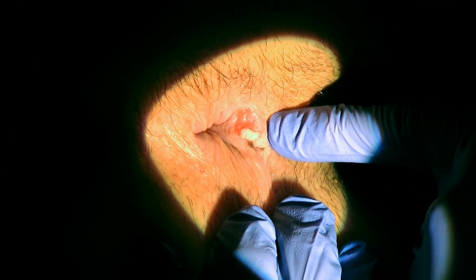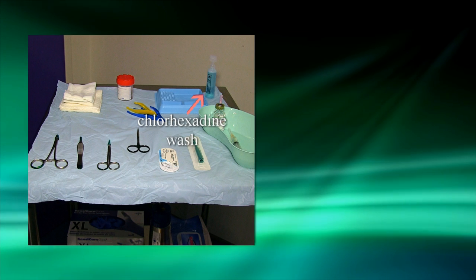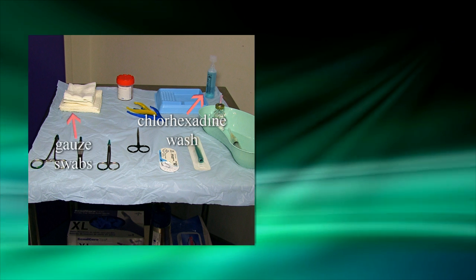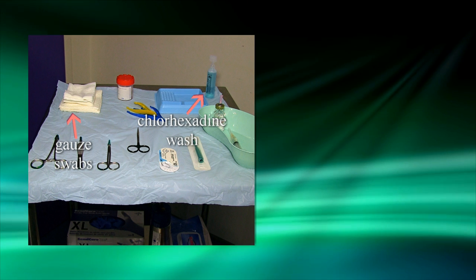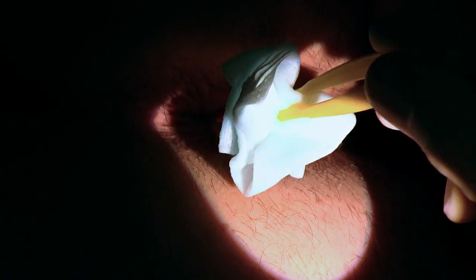I'm going to take a biopsy from that area which is still quite angry looking. I'm using some chlorhexidine wash, which I'll be applying to the area using a gauze swab. This is a little bit cold and wet, so don't be surprised if it feels a little unpleasant — just coldness and wetness, just cleaning the area. You'll also notice a bit of dribbling down your left buttock. I'm making sure I'm starting proximally and going distally.